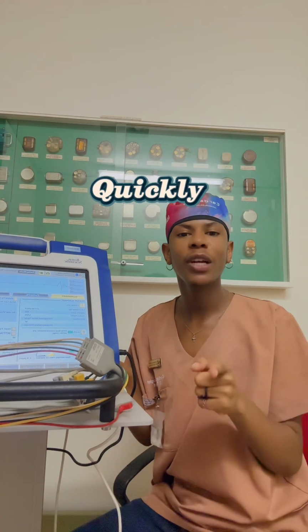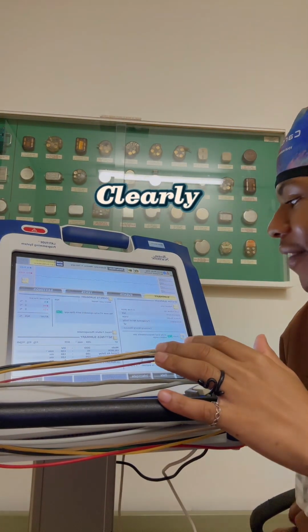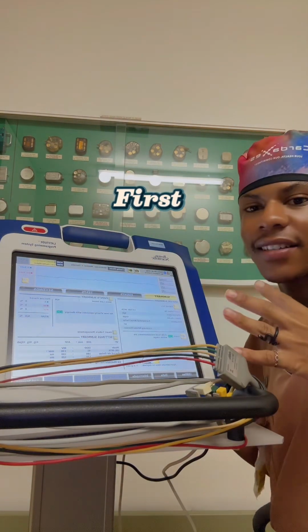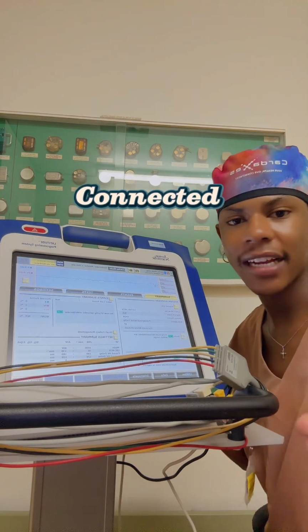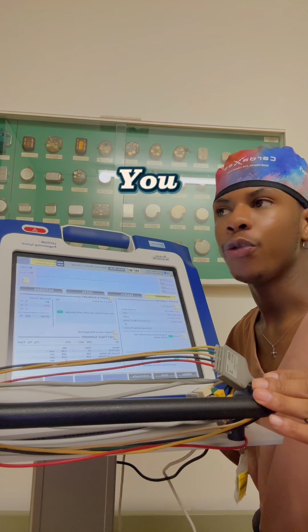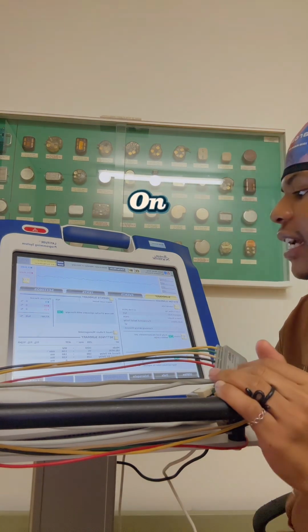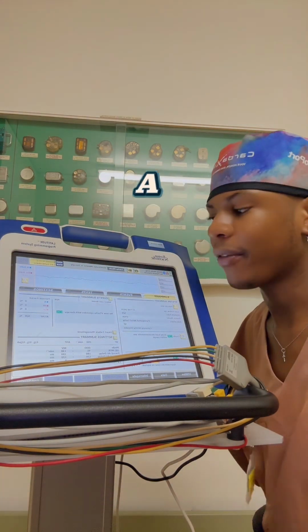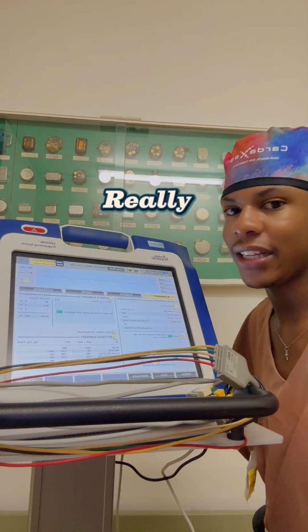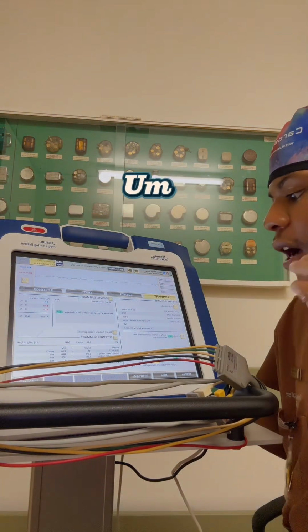So let me quickly show you how we do the device test. I'm not sure if you can see the screen clearly, but this is the first screen that appears, and usually the ECG is connected to your patient, so you are able to see the rhythm that your patient is on. Obviously now we don't have a patient connected, so we cannot really see a rhythm. So what we do is look at the summary screen.